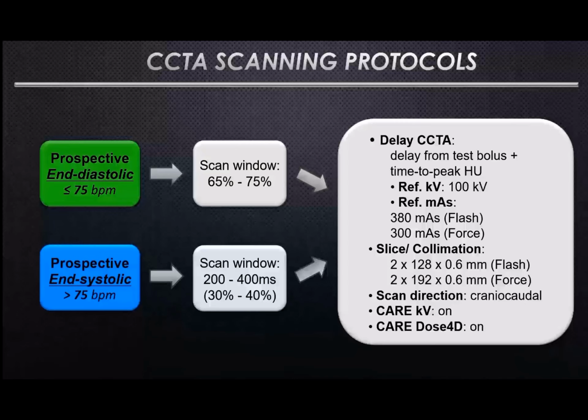If you really want to go to lower dose levels, you can also narrow the scan window further to 68 up to 72, for instance. However, when we scan 10% of the heart cycle, in the case of motion artifacts, this allows us retrospectively to also play around with the best phase, and then you probably can overcome some motion artifacts.